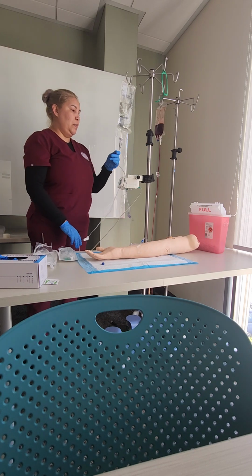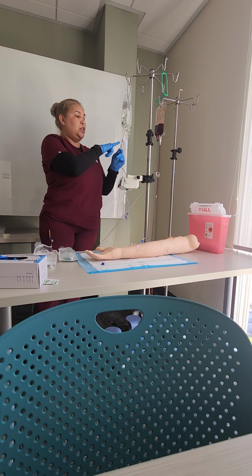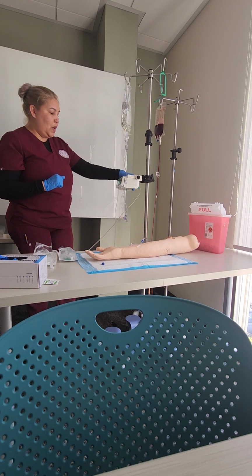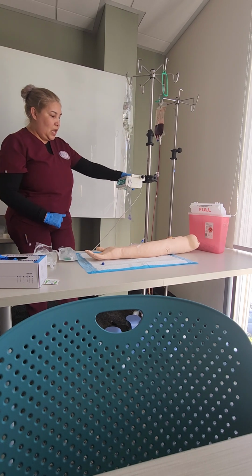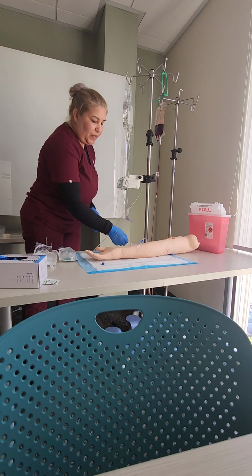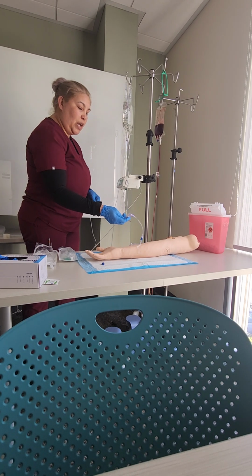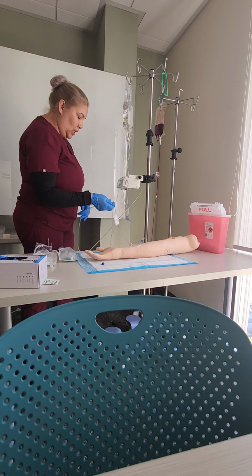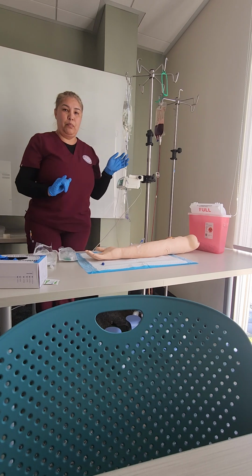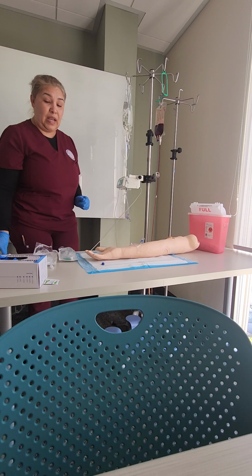What I want to see to make sure that it is being infused into my patient is that there is a drip coming down, and I also want to check that the machine is working properly. Okay, so I check everything before I leave the room. I want to make sure I check my IV tubing starting from the patient, back up to the IV. It is going well. Perfect.